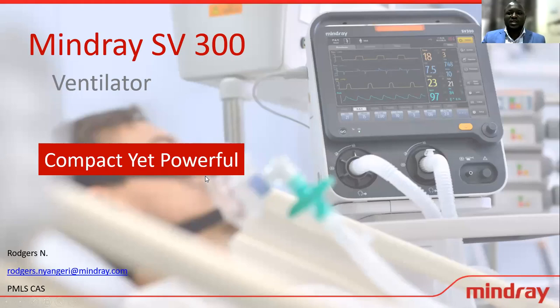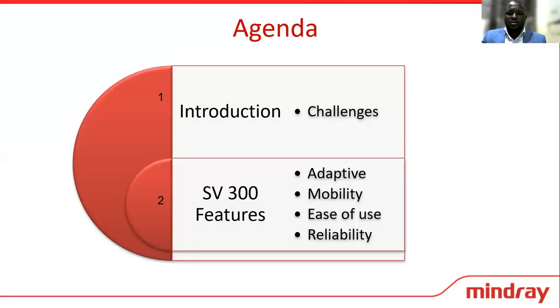So let me share the screen with you. Mindray SV300 ventilator is a turbine-based ventilator, which means you only require oxygen for you to be in a position to run this ventilator. You don't need to have a medical air. So straight into the agenda, we're going to look into the challenges that we face every day in the management of our patients in the critical care setups. And the second agenda is that we're going to tackle those challenges one by one with the use of the SV300 and see how we can manage all that.